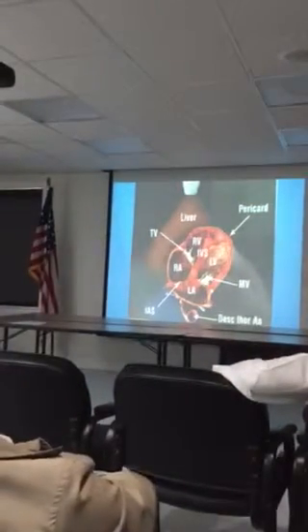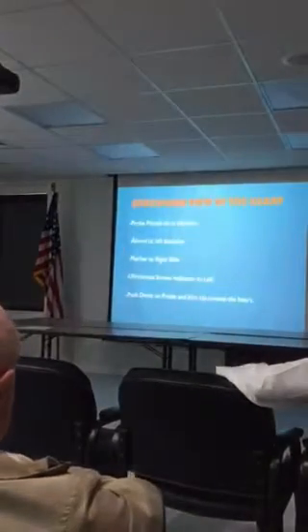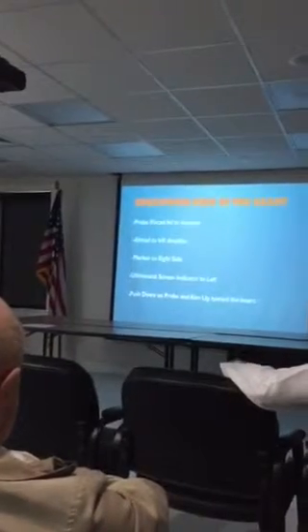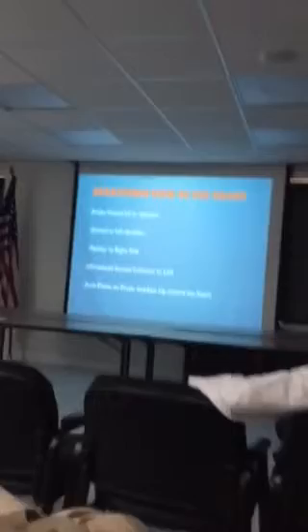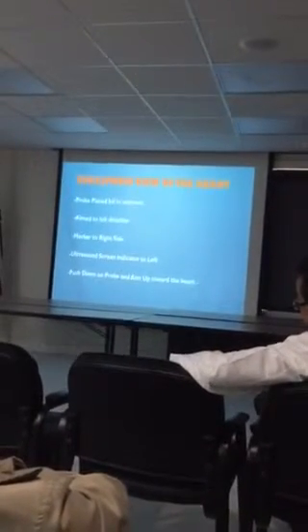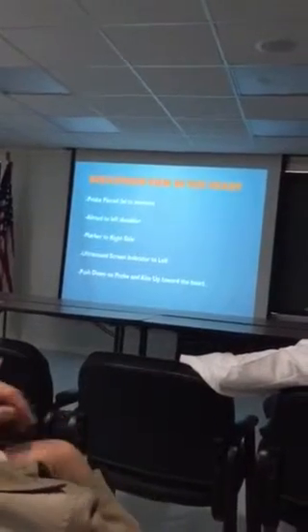Alright, so another study here, the subxiphoid view about the heart. This is a very important study. Usually cardiologists do a study of the heart in 4 views: the parasternal, apical, and subxiphoid views. In the emergency department, physicians start with the subxiphoid view. We make sure the patient doesn't have any cardiac tamponade in case the patient comes in with trauma. This is the first view that we do.